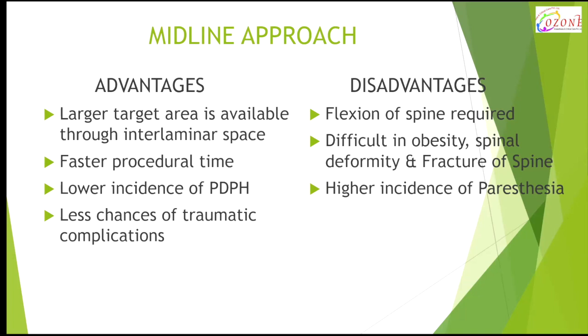Disadvantages of the midline approach are that flexion of the spine is required, and it is difficult in obesity, spinal deformity, and fracture of the spine. There is a higher incidence of paresthesia.